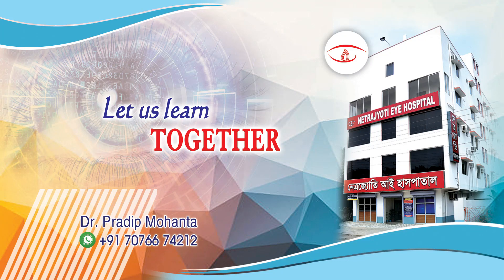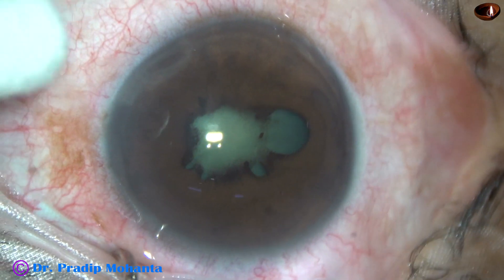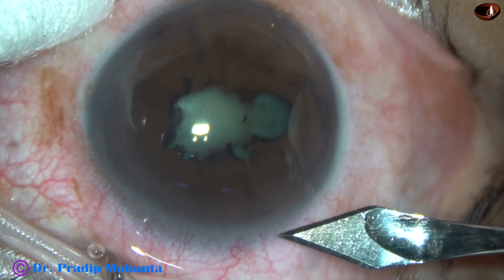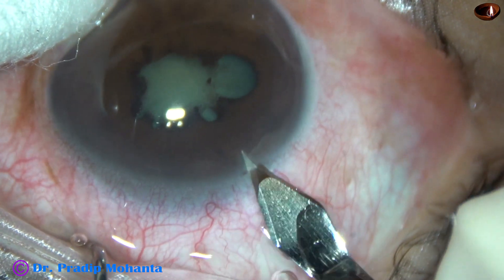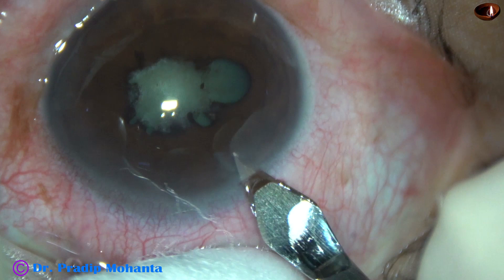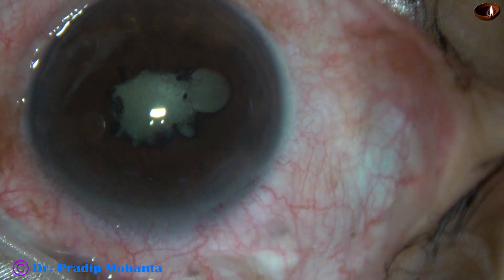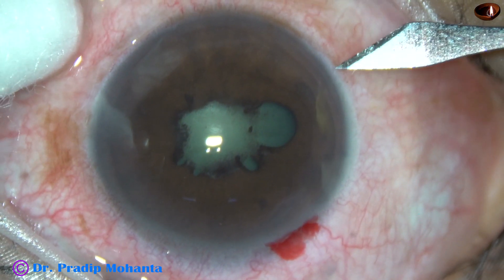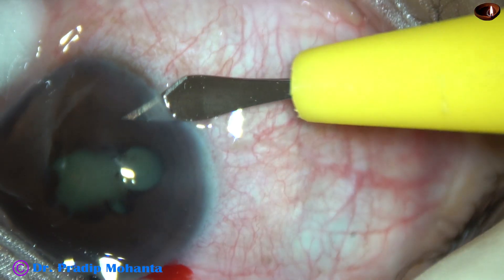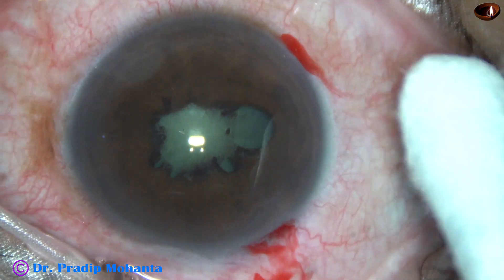Friends, welcome to my workplace at Rana Ghat, West Bengal, India. This is a cataract with posterior synechia. The patient had frequent attacks of anterior uveitis, and the pupil has taken this flower petal appearance after dilatation with tropicamide and phenylephrine. I have taken up this case for surgery. Let us observe the surgical steps.